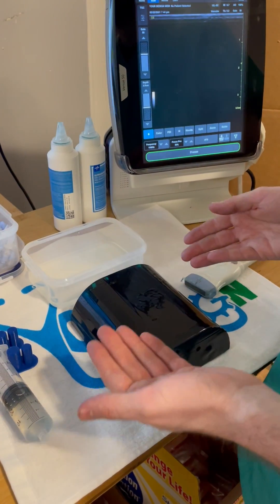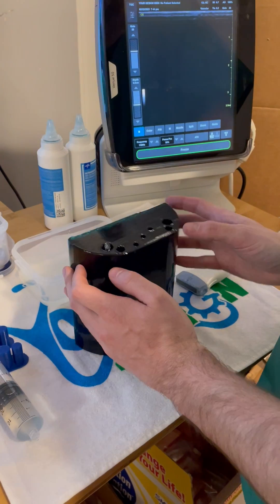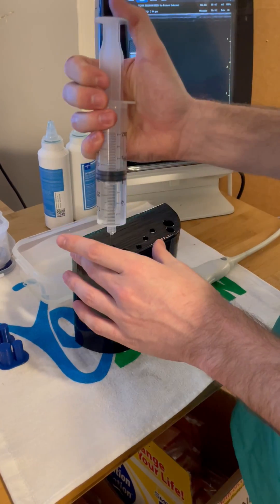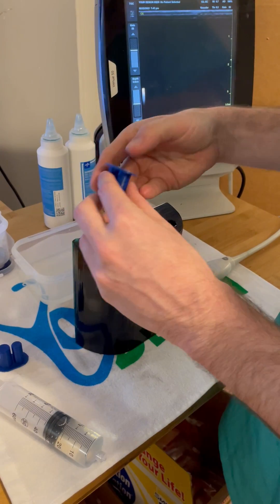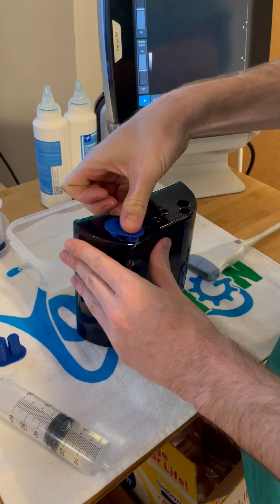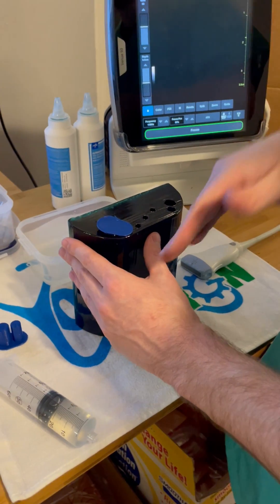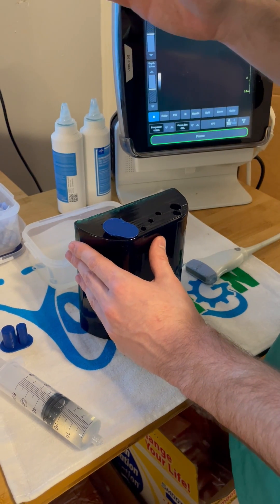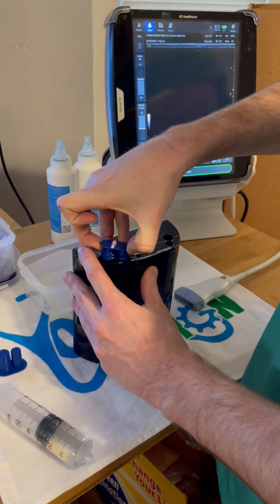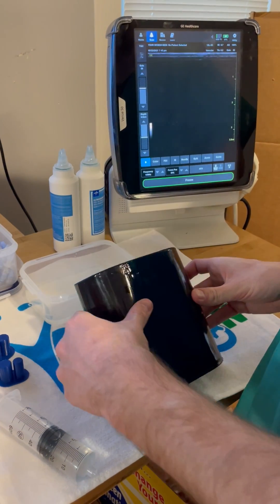If you find that you lose a lot of fluid, or your table tilts down for example, you can add a little bit and cap it with the plastic fittings enclosed. The downside to capping it is that when you place the Central Line, you can't actually have the catheter come all the way through and out. So I generally recommend, as long as the water doesn't bother you, leave it open and just lay it down slowly.